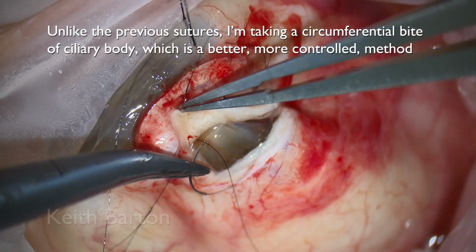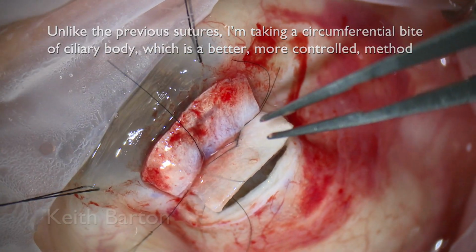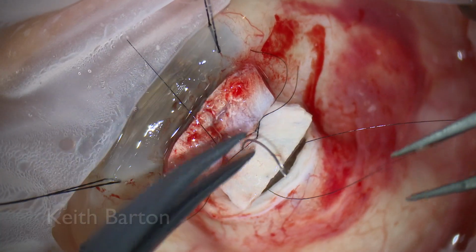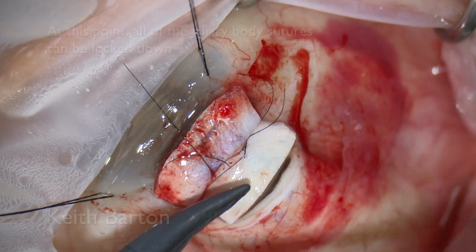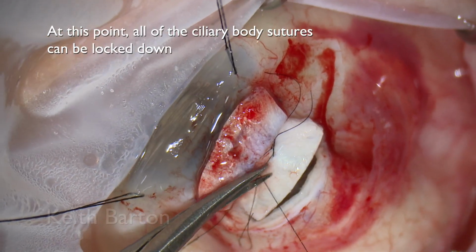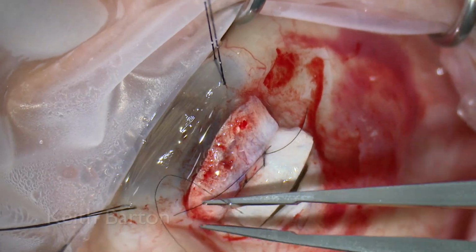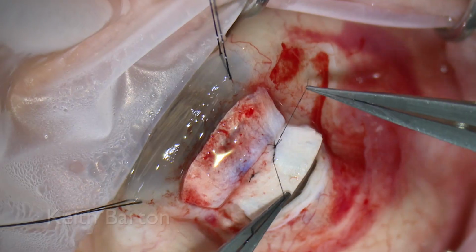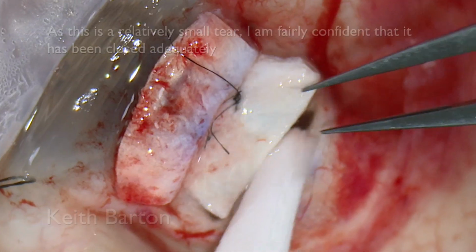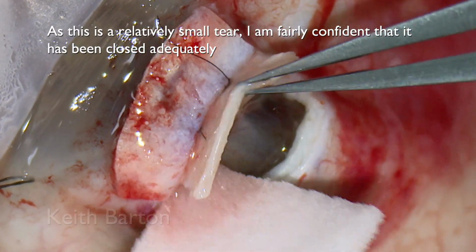Unlike the previous sutures, I'm taking a circumferential bite of ciliary body, which is a better, more controlled method. At this point, all of the ciliary body sutures can be locked down. As this is a relatively small tear, I'm fairly confident that it has been closed adequately.